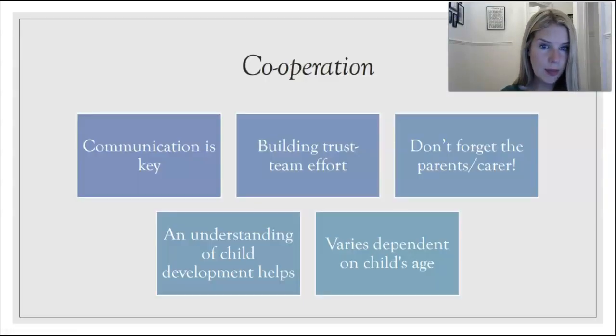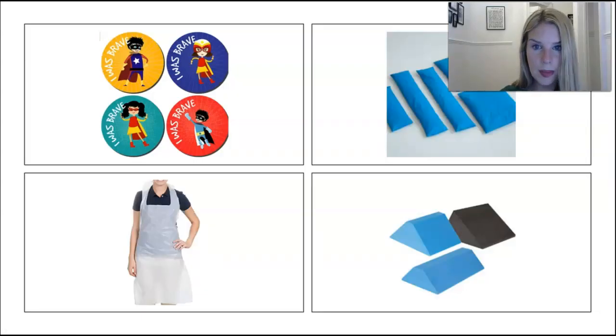So here's some pictures just of what we use. There's some sandbags at the top right hand corner, some pads, some aprons, and some stickers.